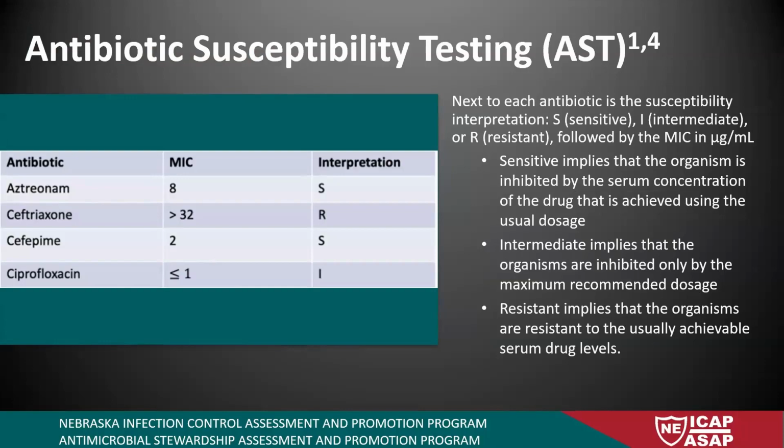And it tells you that the patient had Klebsiella oxytoca and had a KPC gene identified on the same panel. I would like to make the caveat that just because both of these are resulted on the same thing, it's not 100% saying that the Klebsiella oxytoca is the KPC producer. Sometimes these are super, super sensitive tests and they can detect colonization with a KPC. That doesn't mean that the organism they identified is necessarily the culprit. It may not be the Klebsiella oxytoca that's causing the carbapenemase to be picked up.